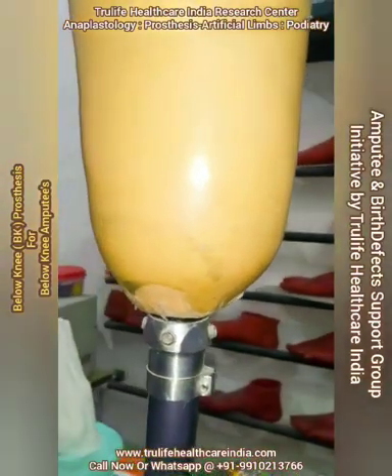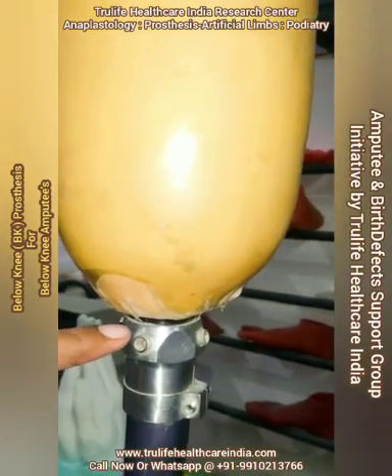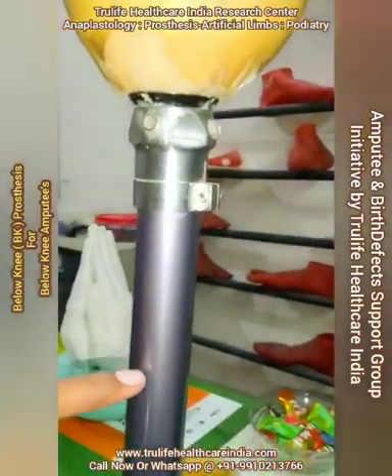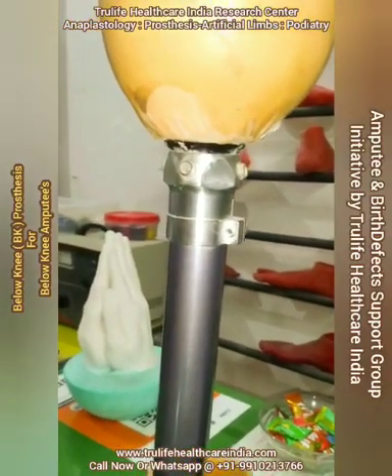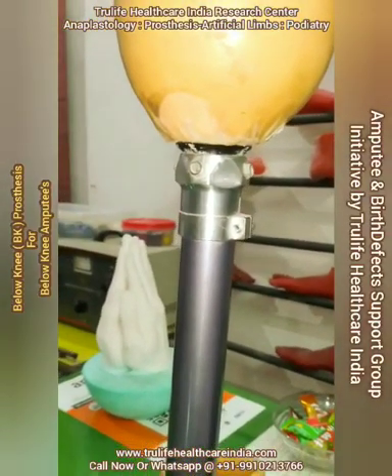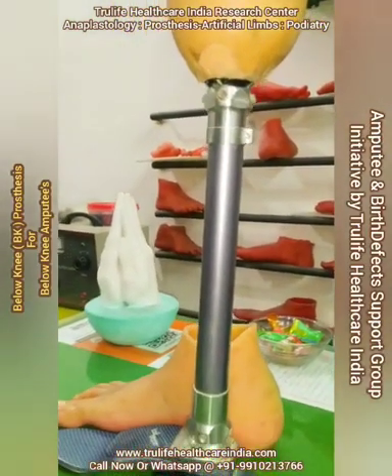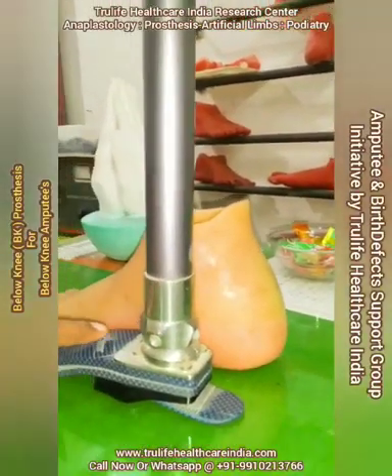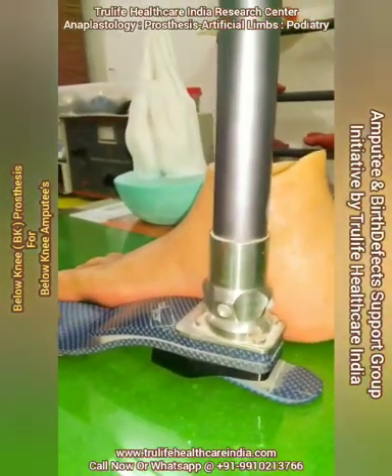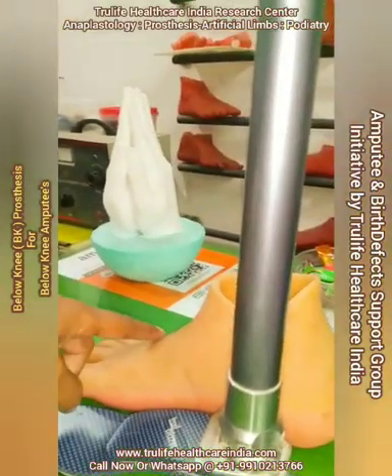Next we have the socket adapter, where the socket is fitted. This is the pylon, with which the height can be adjusted — the length or height can be reduced and alignment can be done. Here we have the foot adapter, and this is the carbon foot.